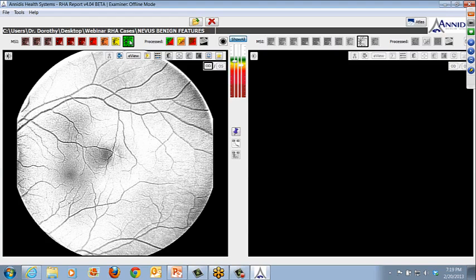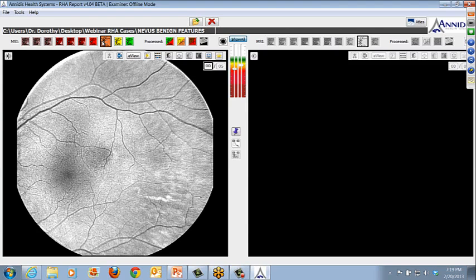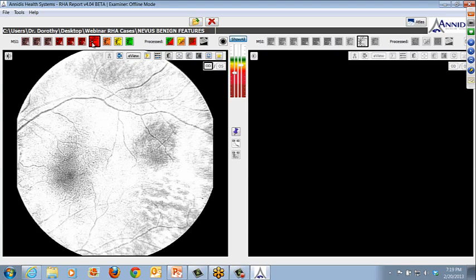Do melanoma really derive from nevi? There's even some debate about that, okay? So let me just make that clear as we talk about nevi. But all the principles that we've learned from all of the studies so far to date don't change as a result of multispectral imaging. So you need to remember all those principles. So symmetry or asymmetry, borders, the color of the lesion, and the depth of the lesion are all important things that you need to pay attention to. MSI helps differentiate things a little bit differently. I'm going to walk you through what I mean by that.